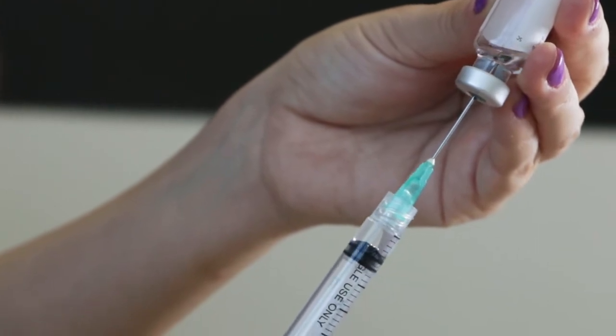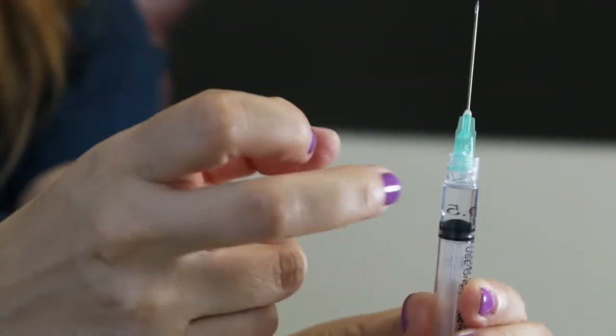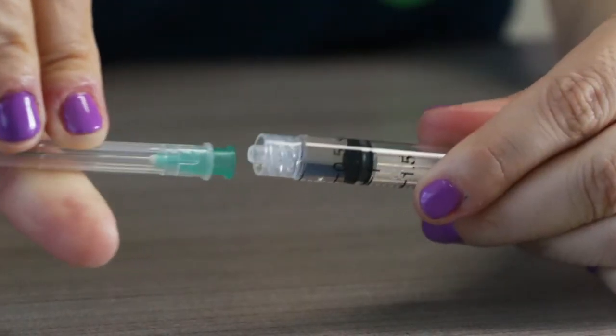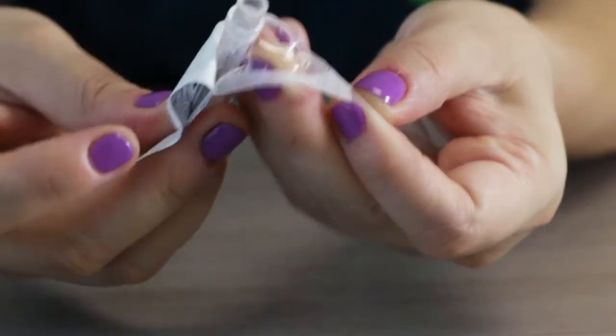Suck in the entire diluted content of the bottle and make sure you don't draw in any air. Then, replace the needle with a thinner and shorter one.